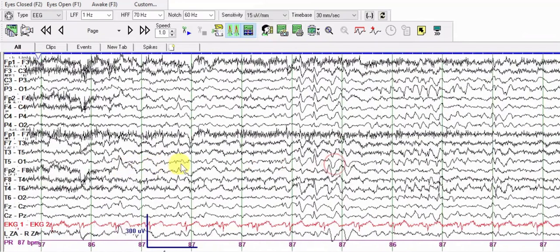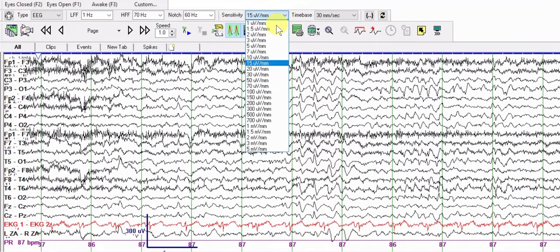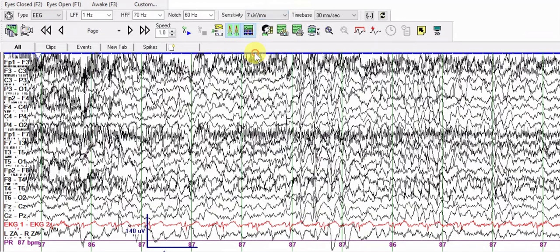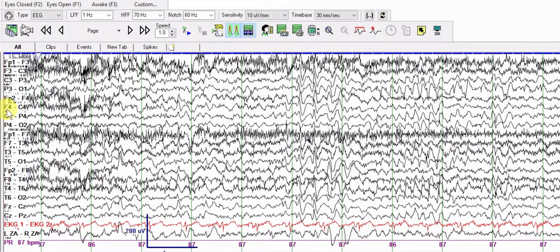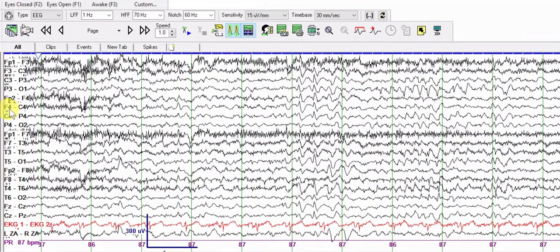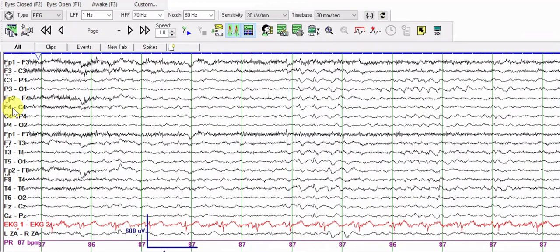Going back to 15 microvolts, we see a burst of sharp and slow discharges. To confirm these are not just low amplitude sharp waves, go back to 7 microvolts per millimeter and see what that looks like, then try 10, 15, 20, and 30 microvolts per millimeter — you can see the difference.